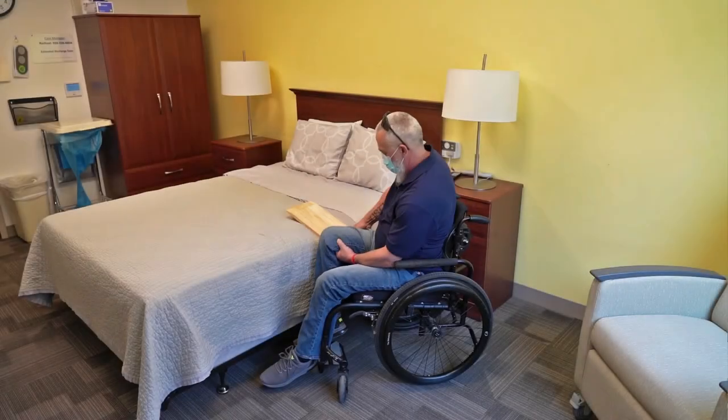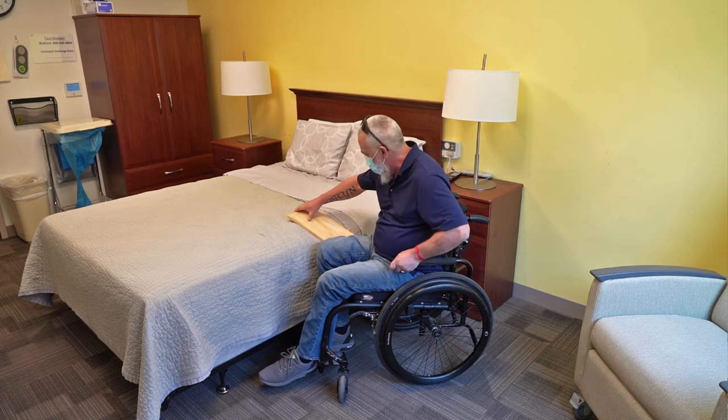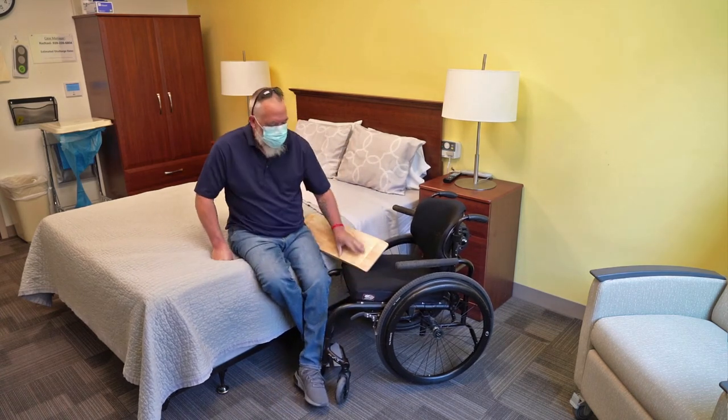You're going to lift my leg up, get the board underneath my hip, pick myself up, and slide on over.